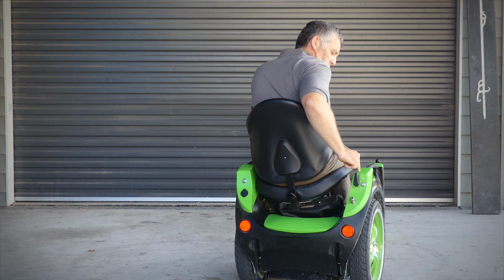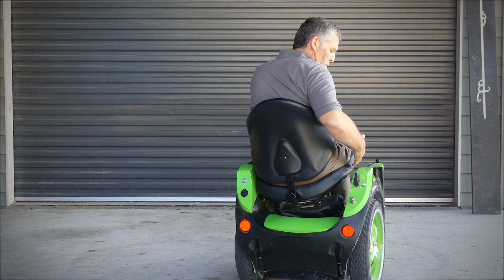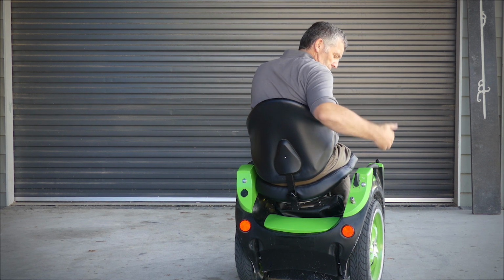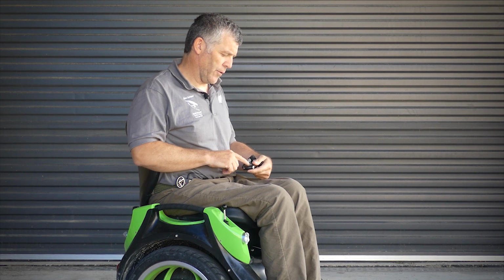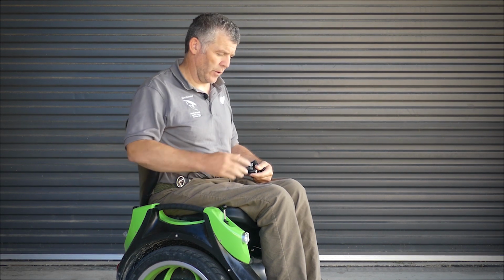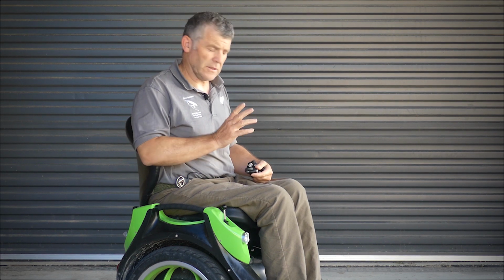So we've gone from seat steer back up to joy steer, and the differential between the two have caused the machine to go into an emergency override shutdown. Always check the info key, look for an error. If it's a steering sensor error like we've just created by switching over quickly, it should come up EO14.